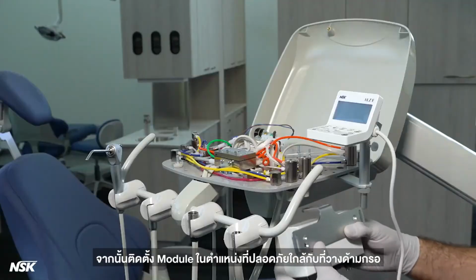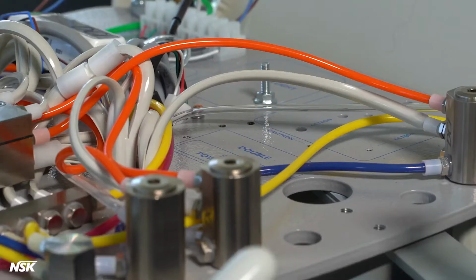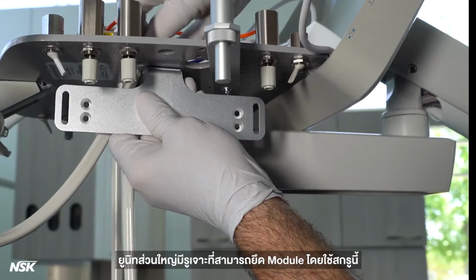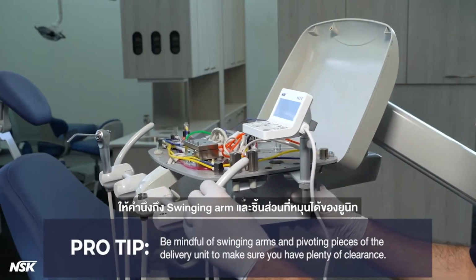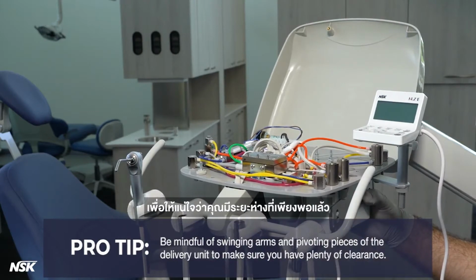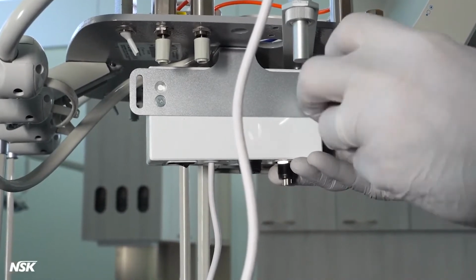Next, mount the module in a secure location that is close to the handpiece hangers. The ideal location is under the tray. Most delivery units have preset drilled holes to mount the module bracket using this screw. Pro tip: when selecting your mounting location, be mindful of swinging arms and pivoting pieces of the delivery unit to make sure you have plenty of clearance. The module itself is mounted on the bracket using the 2 flathead screws.